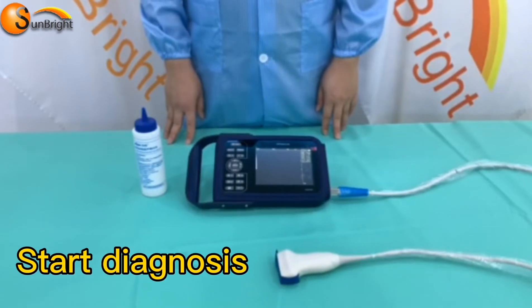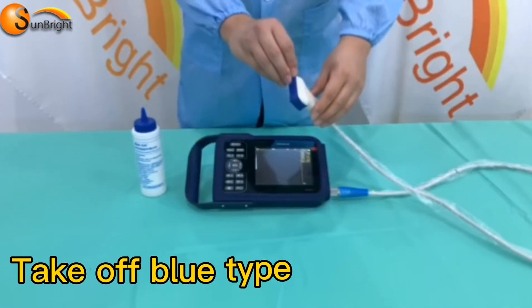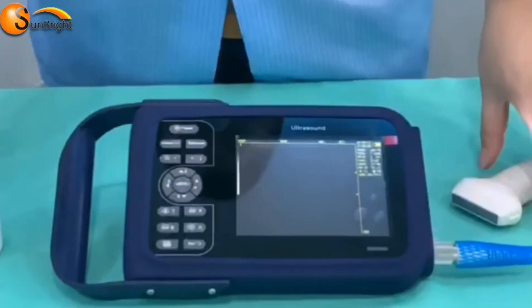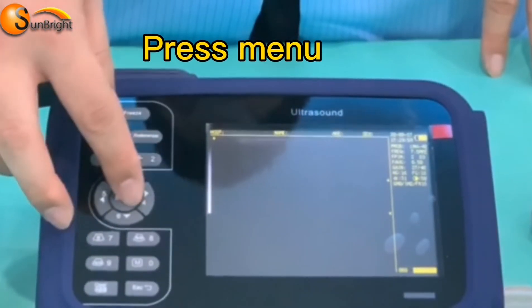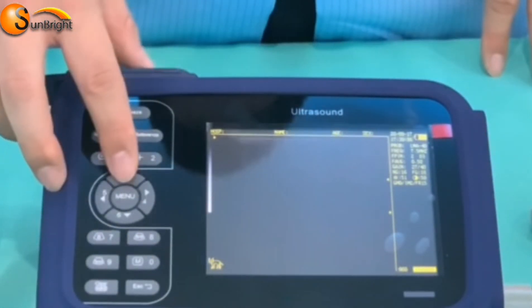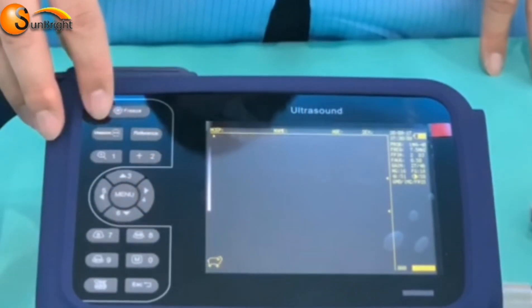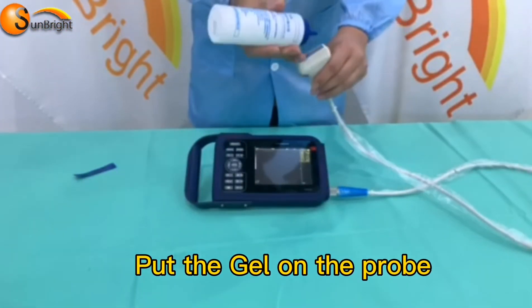Let's start diagnosis. Take off the blue tab before scanning. Press the image key, then press Menu, and press number seven to choose the body mark. Press the direction key to choose the animal type. Begin scanning and put some gel on the probe.